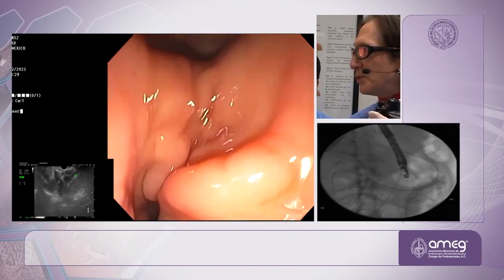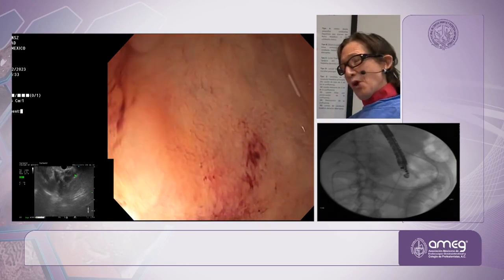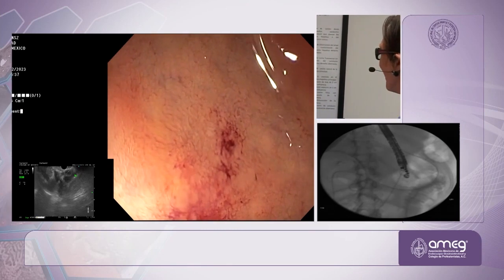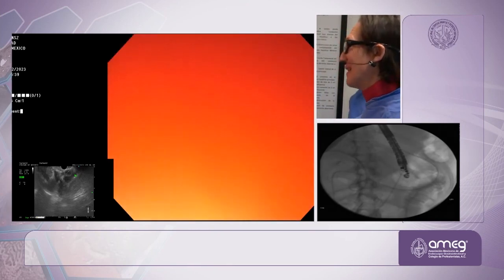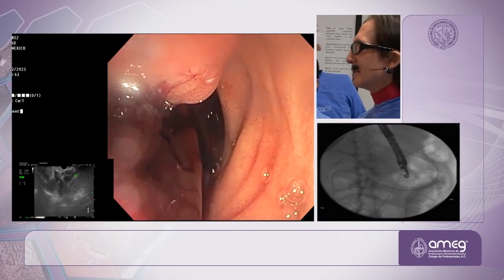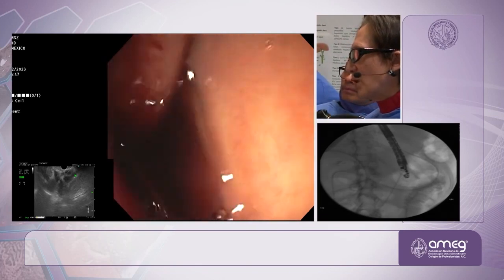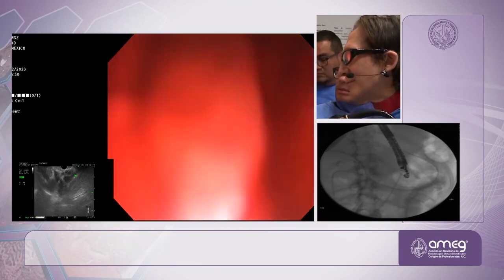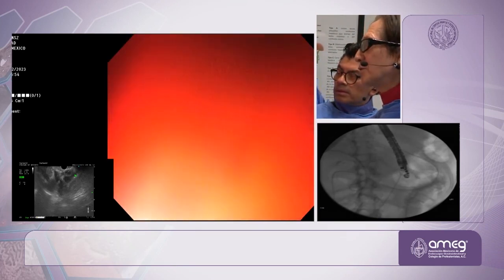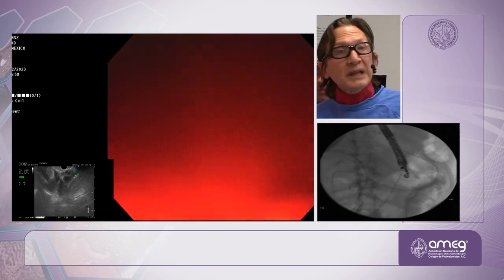And this is one of the reasons why everyone talks about duodenal stent or GE. Which one? I say, do both. It's possible, if you can. Yeah, both. Now, in this case, she doesn't need a duodenal stent because I can get through with the double channel scope without any problem, you see? I'm just going right through it. But if I couldn't go through, it's very friable, so I'm not going to push through, then I would place a duodenal stent.